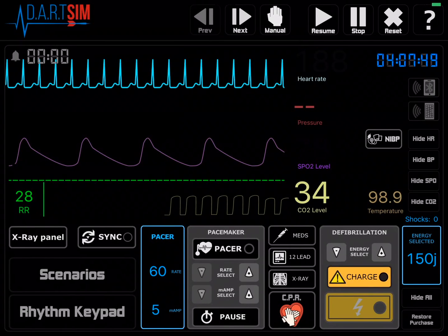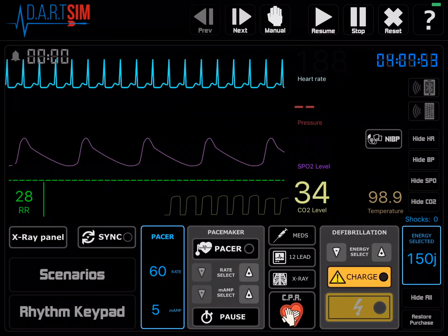This video will show you how to use the cardiac monitor simulator that we'll use for your skills testing. Being familiar with it before you come to class will definitely save us some time.